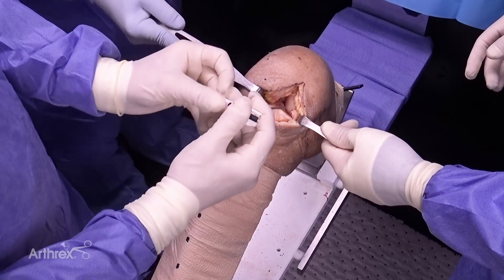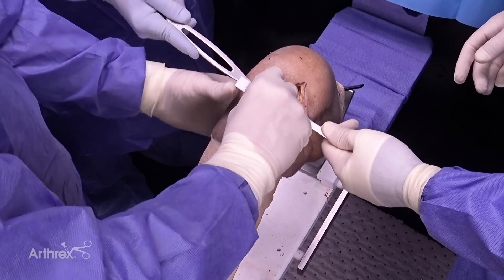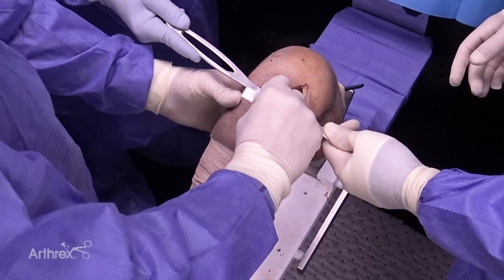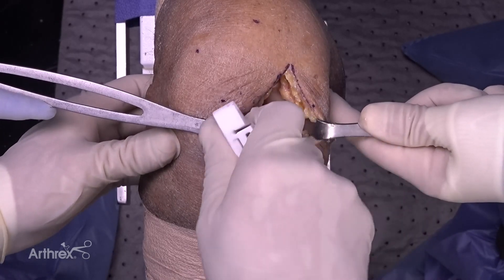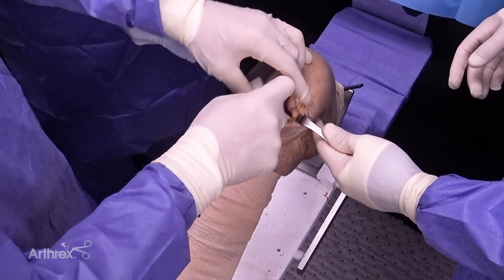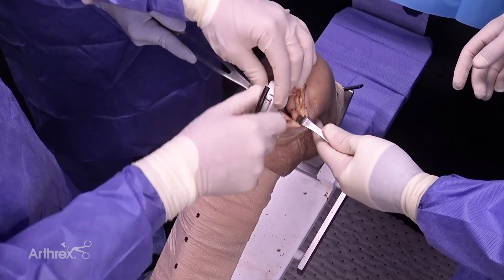I will place it in the joint line and advance it between the tibia and femur. Once I can feel it go right past the tibia, I rotate it 90 degrees. I pull forward, and it catches on the posterior condyle of the tibia.